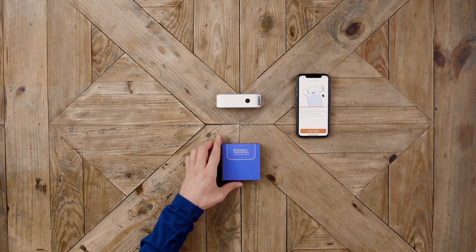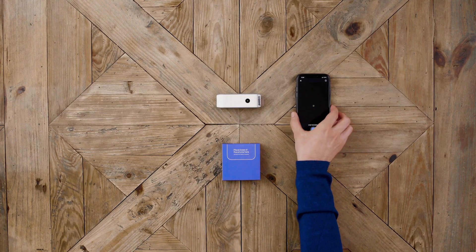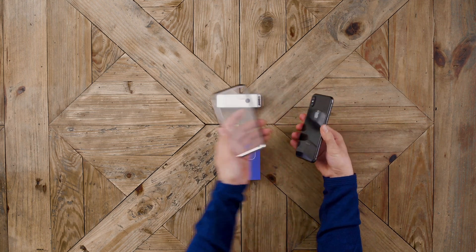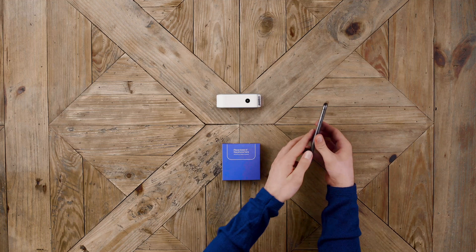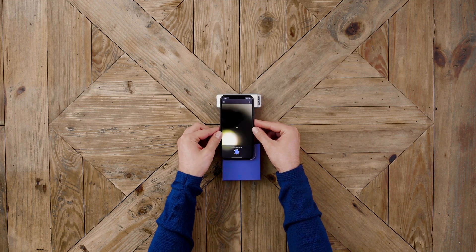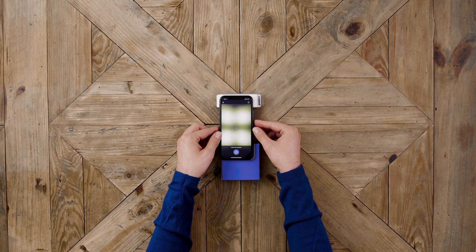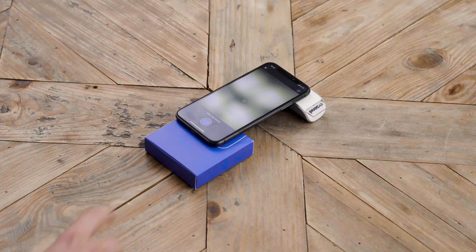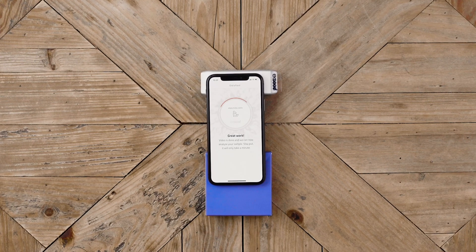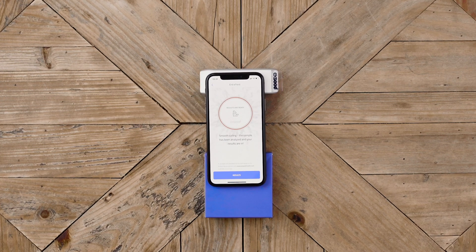You can use the blue slide box for support. If your phone has a cover, please remove it. Put your phone on top of the device and let the light from the device guide you. Make sure you can see all four lights, then press start recording.